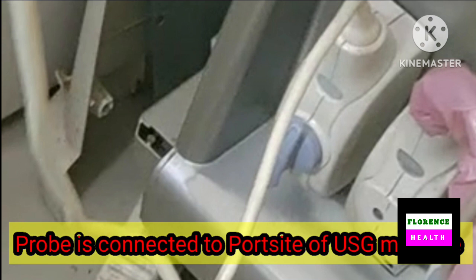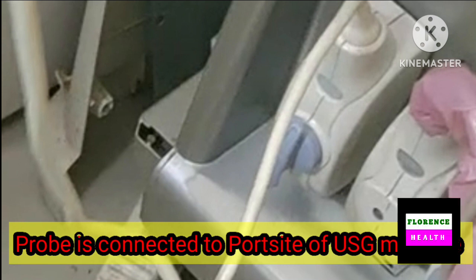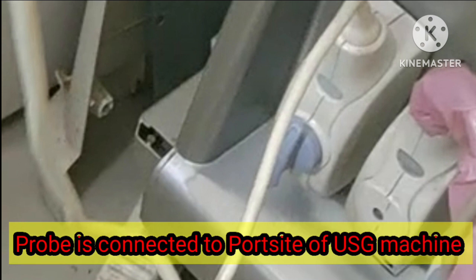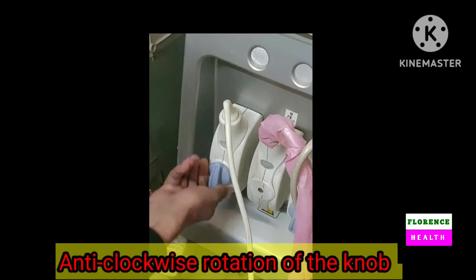This slide showing the probe is connected to port site of ultrasound machine. That is, old probe is connected to port site of ultrasound machine. I want to remove this probe and connection of a new probe to this port site. First step, you should give anti-clockwise rotation of the knob.